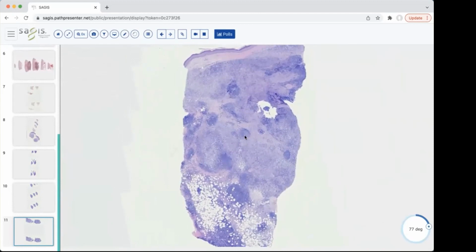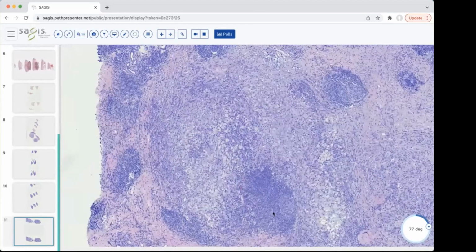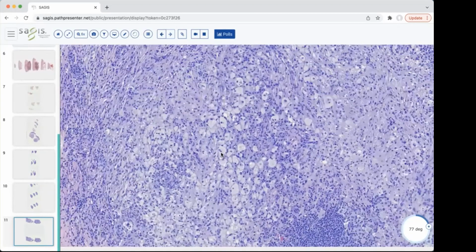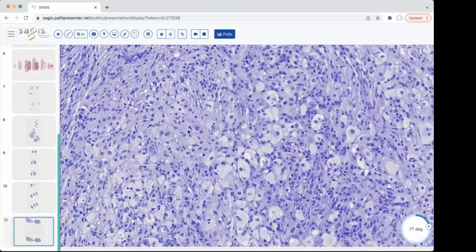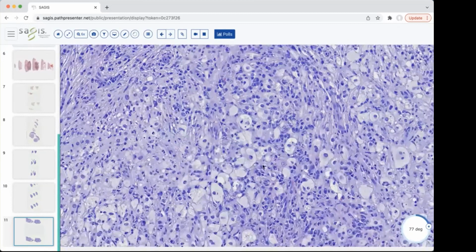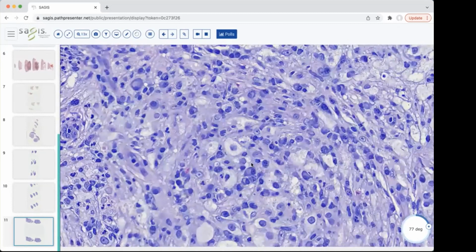Like we mentioned earlier, this is going to be a nodule or a plaque without surface change. And when we come in and look at these areas, we see the darker areas here, a sort of lighter central area here, and very foamy cytoplasm in some of these cells. There are also scattered neutrophils. And as opposed to the last case where the cells had the two-tone cytoplasm, these are usually either just foamy or some of the other cells have their normal eosinophilic cytoplasm.